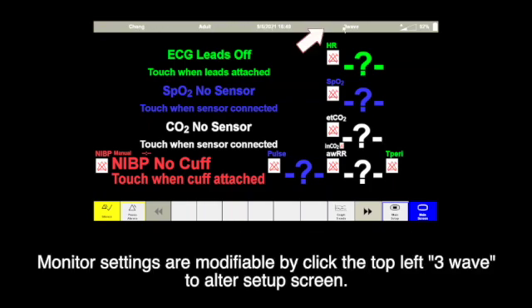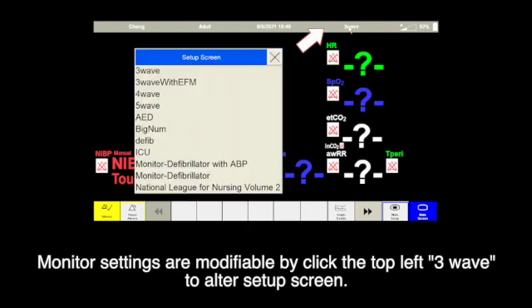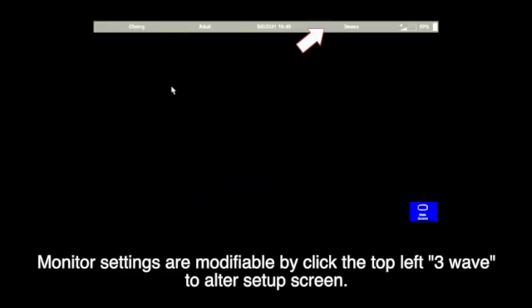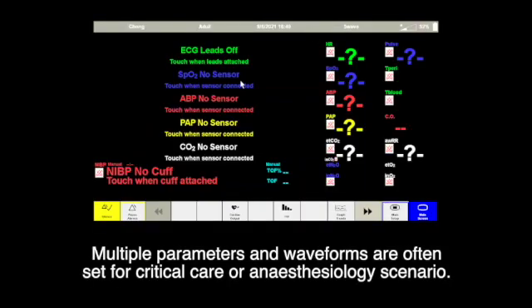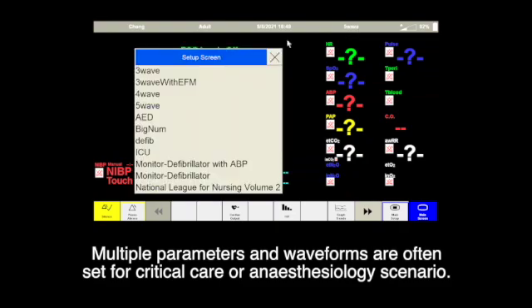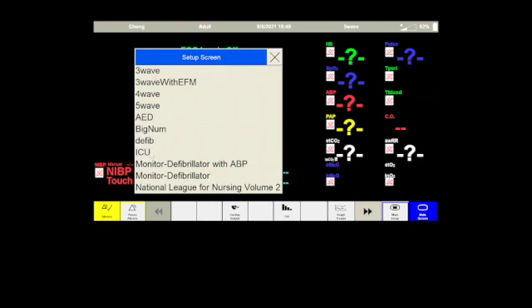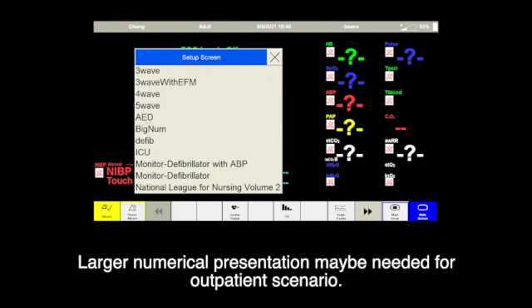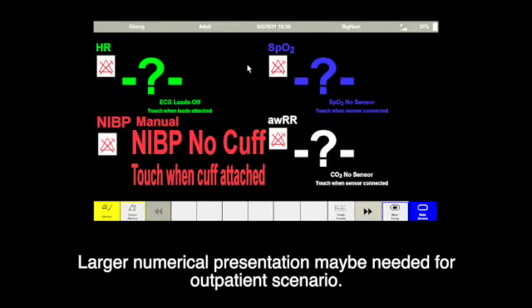Monitor settings are modifiable by clicking the top left 3 wave to alter the set-up screen. Multiple parameters and waveforms are often set for critical care or anesthesiology scenarios. A large number presentation may be needed for outpatient scenarios.